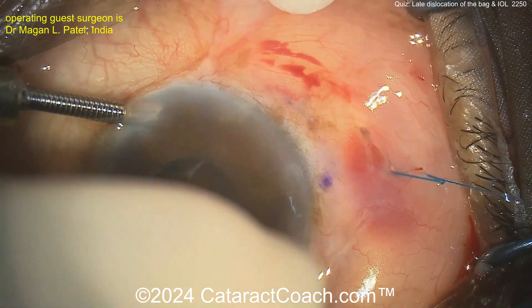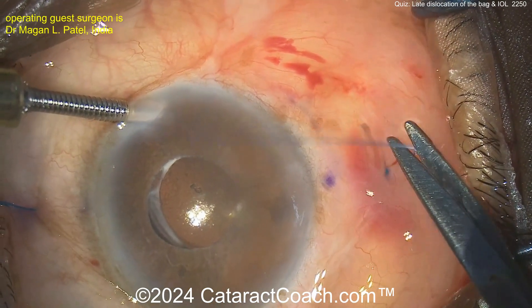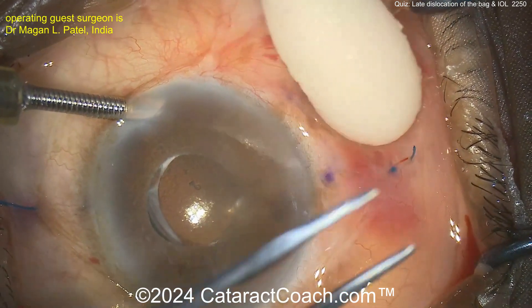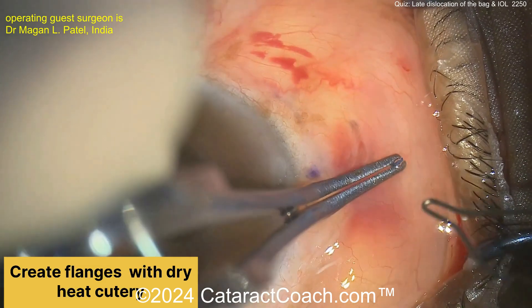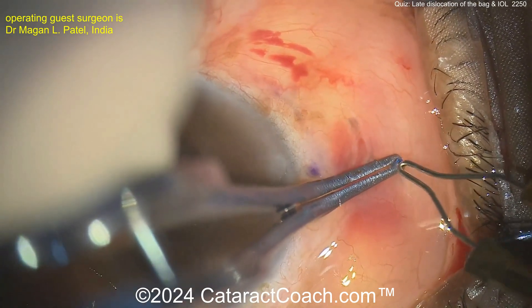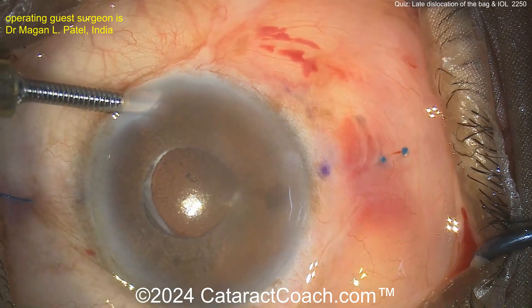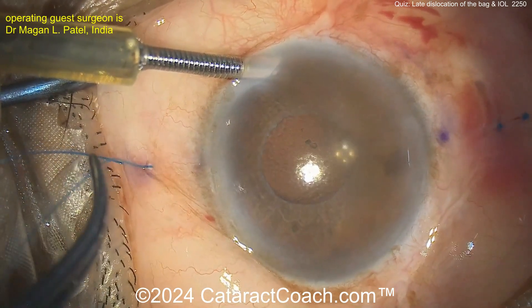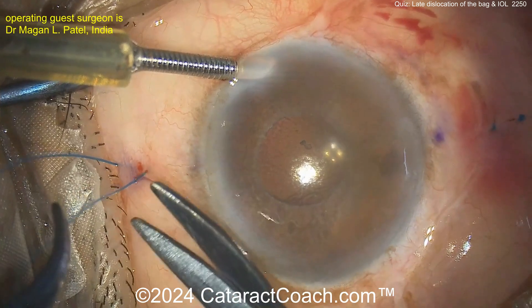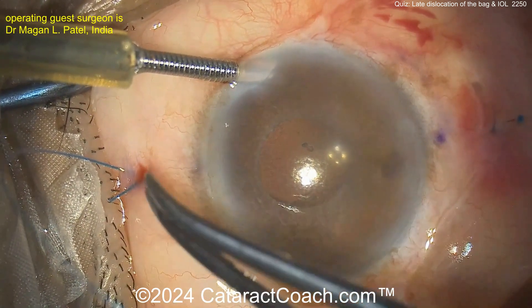Pull, pull, pull — tighten that to get that nubbin down into the sclera. Don't just leave it sitting on top of the sclera above the tissue, because then it'll erode through the conjunctiva. Grabbing that end there, a little bit of cautery — you've got some nubbins — then push those within the sclera. Do the same thing on the other side and this should probably last the patient's lifetime.